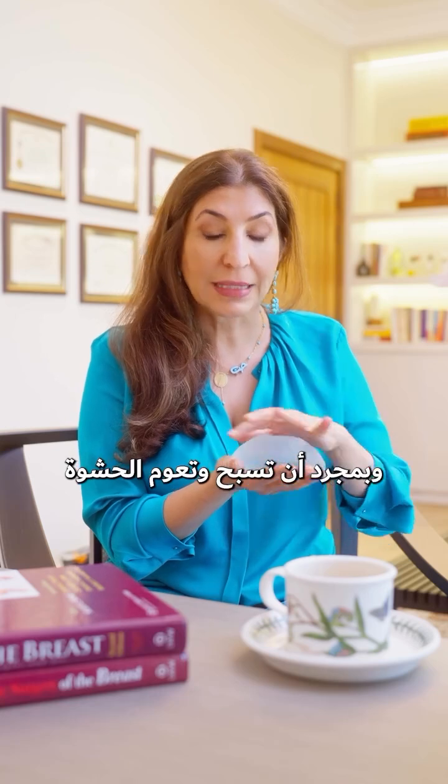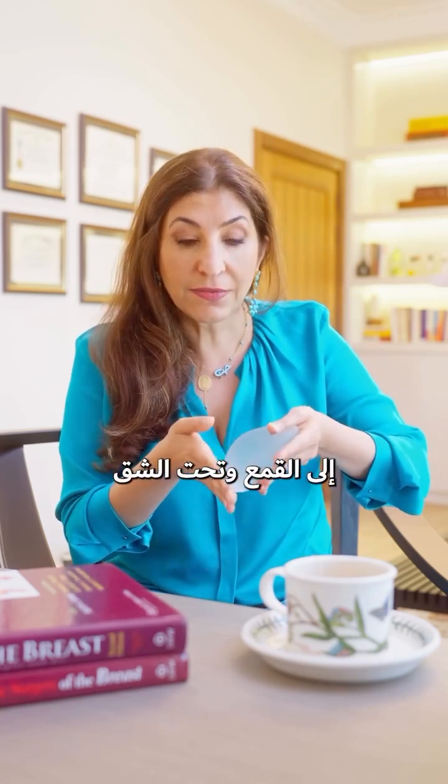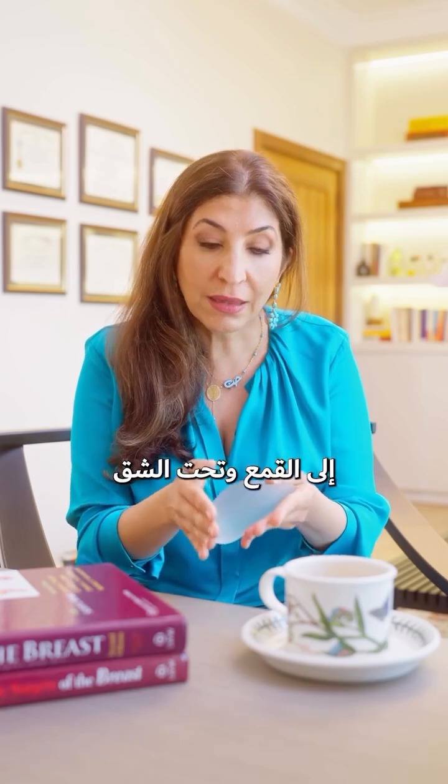Once the implant is swimming in this antibiotic solution, we use a funnel, so you're not touching the implant. The implant is placed directly into this funnel without actually touching it. So it goes from the box into the funnel and underneath the incision directly into the pocket.